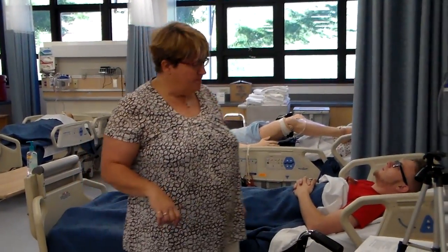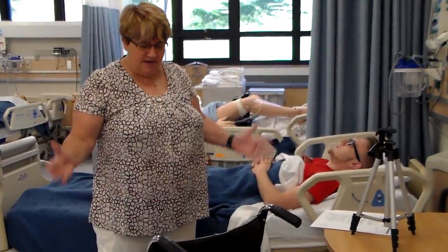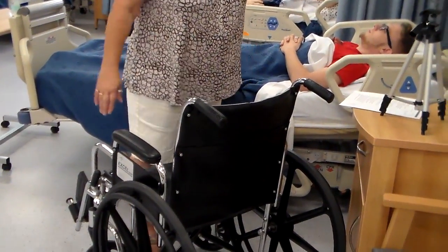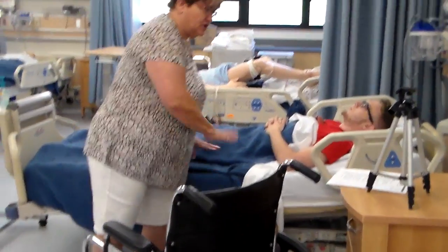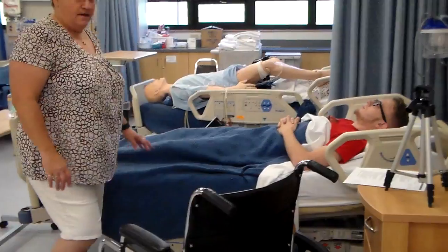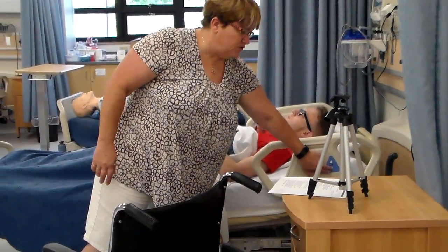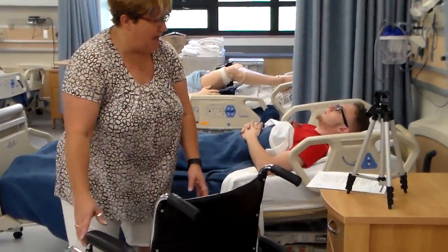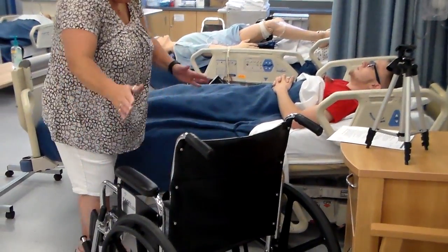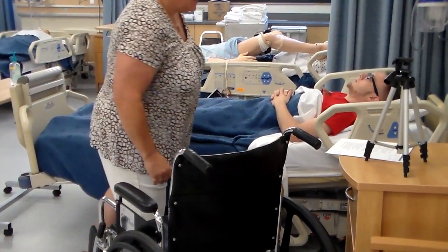All right. So then you're going to position the equipment appropriately. So the equipment is the wheelchair, yes? Okay. So we're going to lower the bed to its lowest position, okay? We're going to lock the wheels of the bed. Then we're going to put the wheelchair parallel to the bed, as close to the bed as possible, okay? So I've tried to get this as close to this bed as possible.